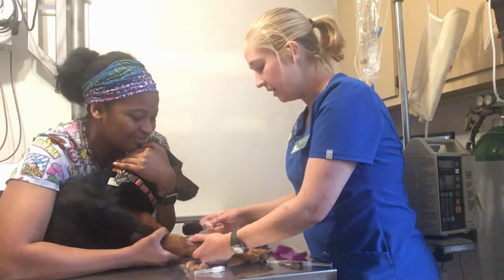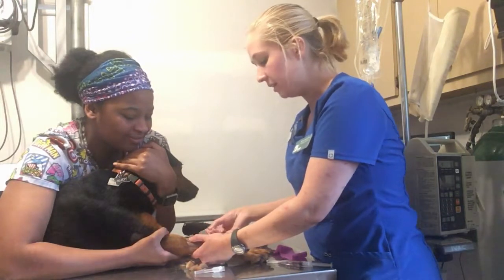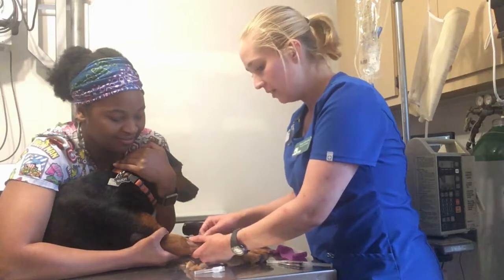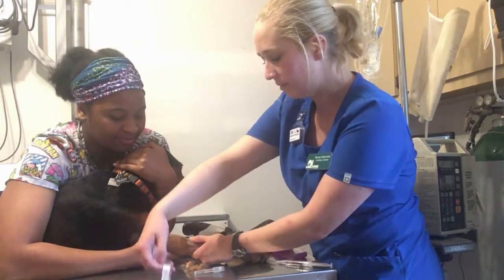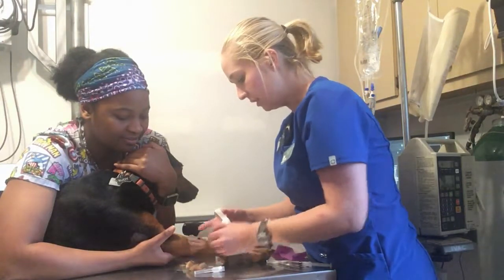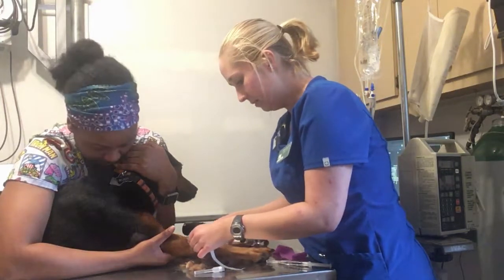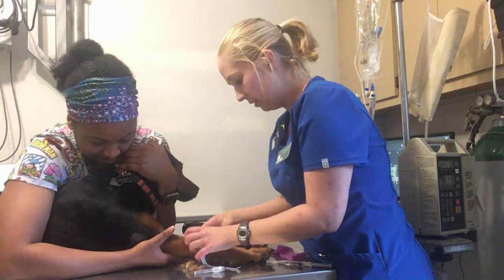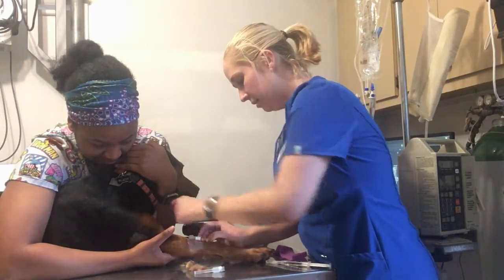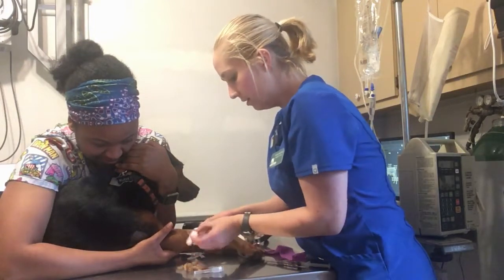Okay, and then next you're going to put in your plug. Get that on. After you get that plugged, I'm going to take my half inch tape and take the catheter.